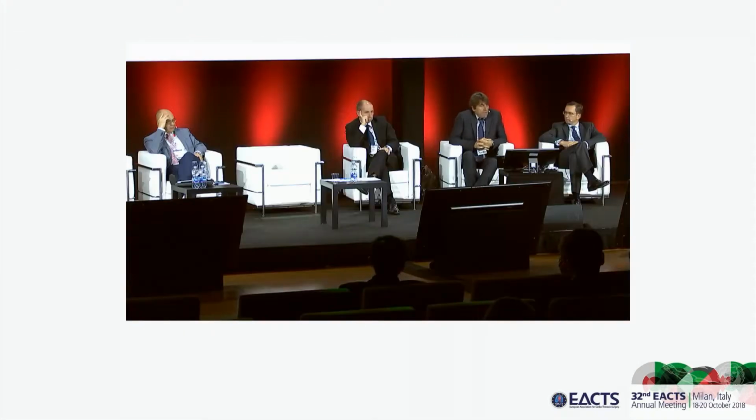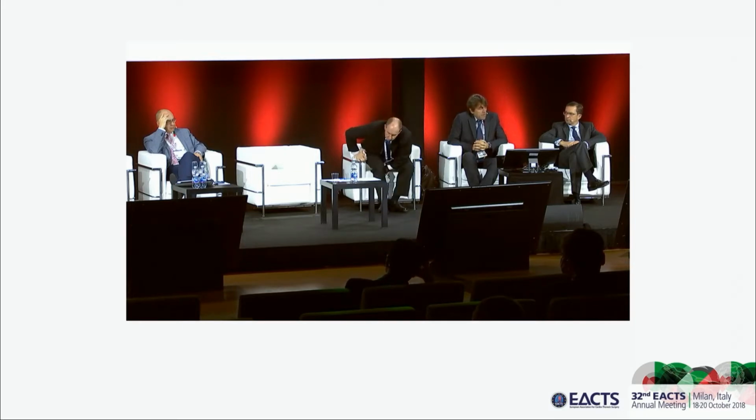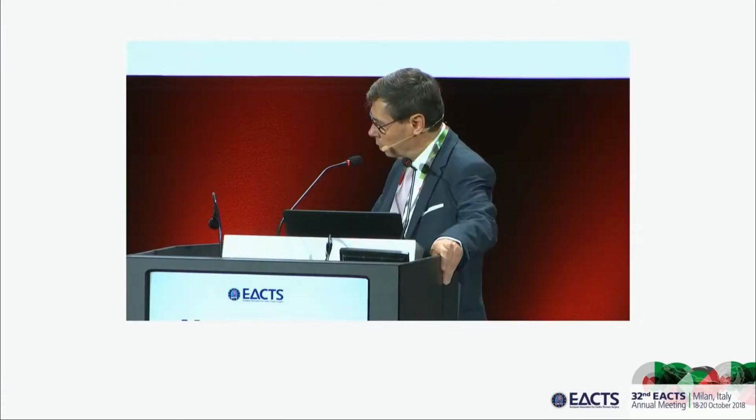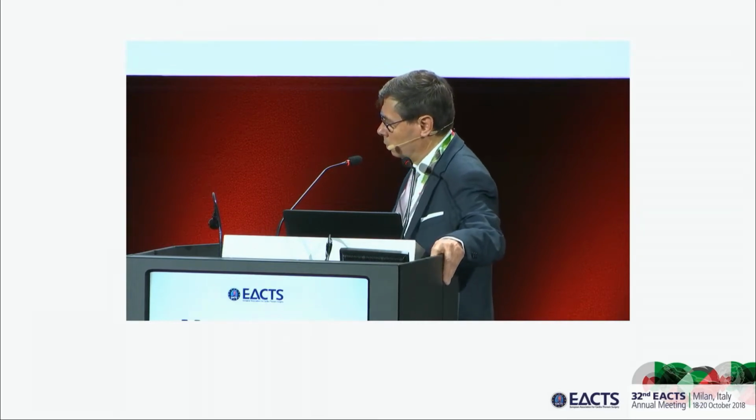Thank you, Michel. As always, very nice explanation of the mechanism of aortic insufficiency, also evaluation for repair. You have shown very well that you can check the coaptation among all three valve cusps, left, right, and non-coronary. So you can go at all levels. But in case you don't have any aortic regurgitation at the end of the operation, even though you don't find the perfect lower coaptation in one couple of leaflets as compared to the other one, how does it influence the next step? Does this information help the surgeon to do something post-repair, just the measurement of the different coaptation between two different leaflets?